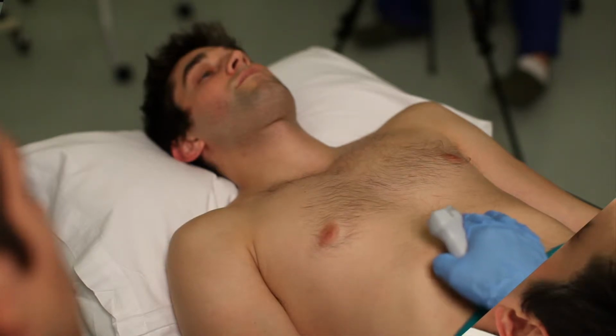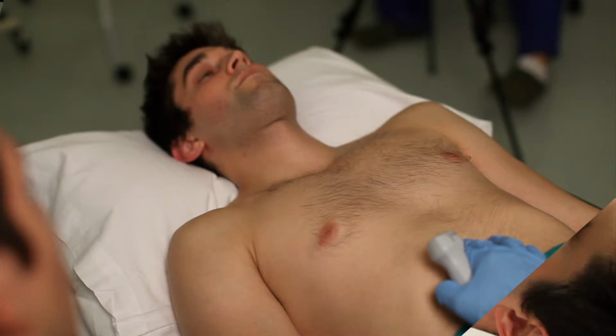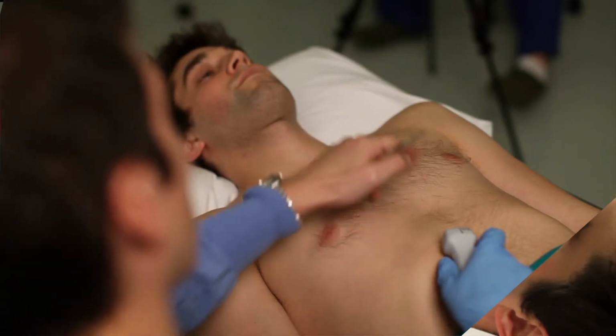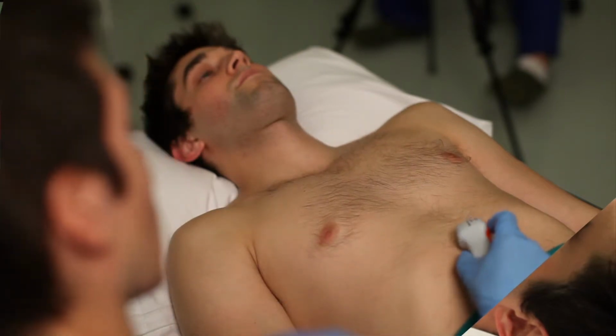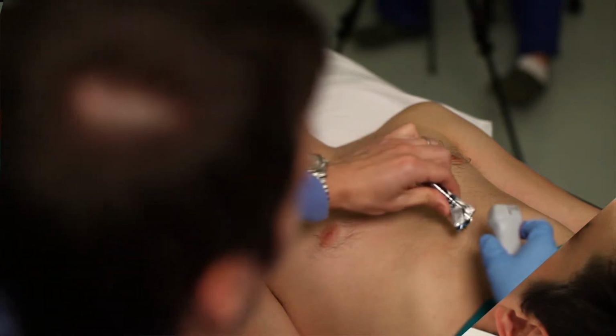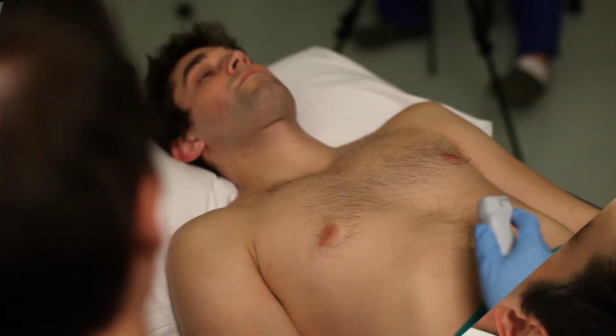The other place that you're going to go aside from this location is slightly to the right of the midline. As the heart is sitting in the chest in this fashion, you're going to want your beam going towards the left shoulder and your orientation notch will be towards the left flank. So a little bit of gel, might be cold. This is a sterile gel packet, but you do not have to use sterile gel.